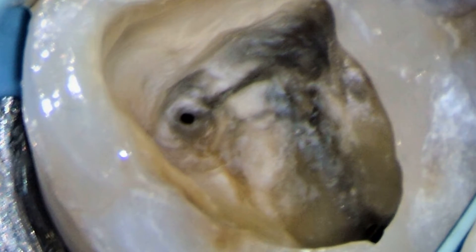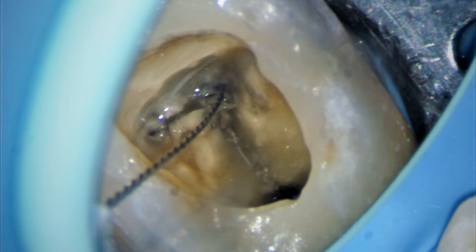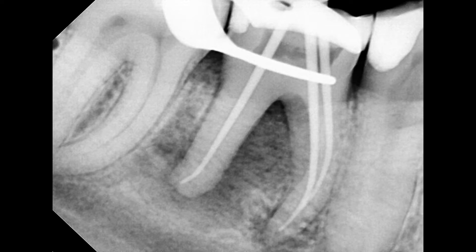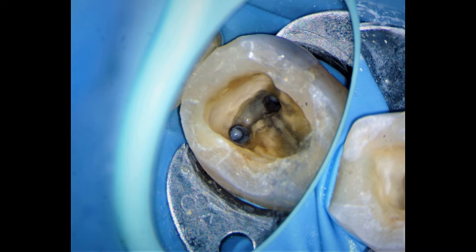After finding the mesial buccal canal, we continued troughing on the mesial lingual canal, and here is the mesial lingual canal that we could locate. This is the radiographic image after the biomechanical preparation of the master cones. This is the neat and clean chamber that you can see when we completed our biomechanical cleaning.